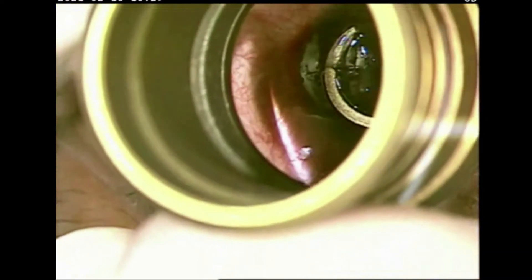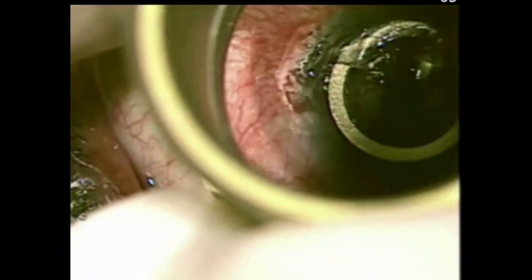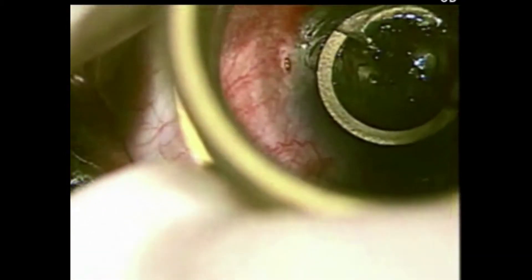Here, as you can see, this is a tunnelizer. I am placing it, and making sure that I am placing it under the corneal ring, into the tunnel, and I am pushing to make the tunnel.